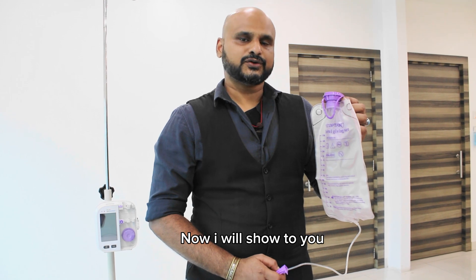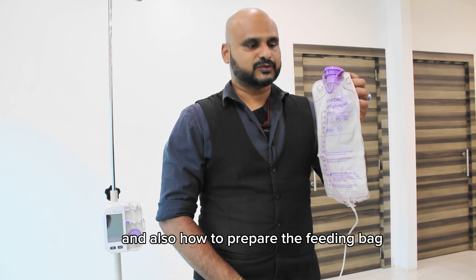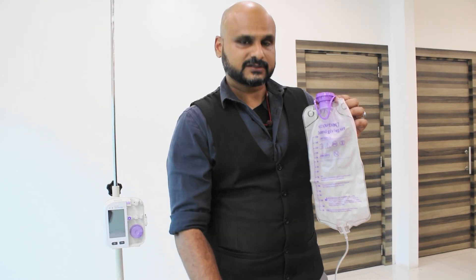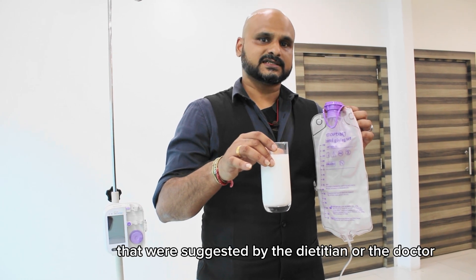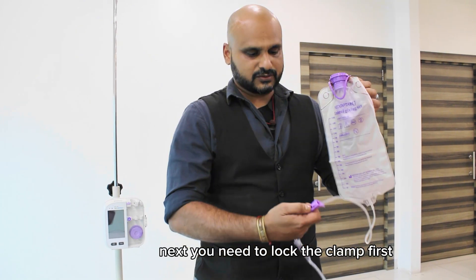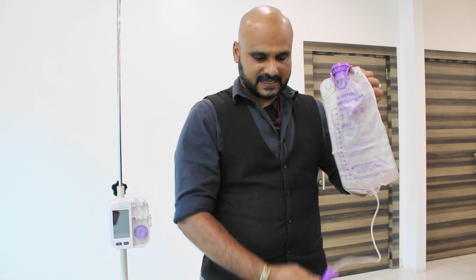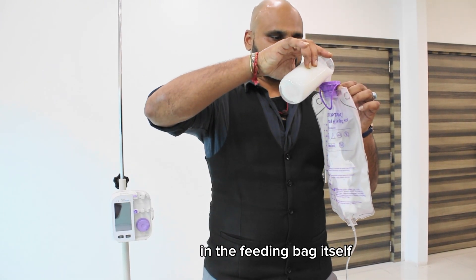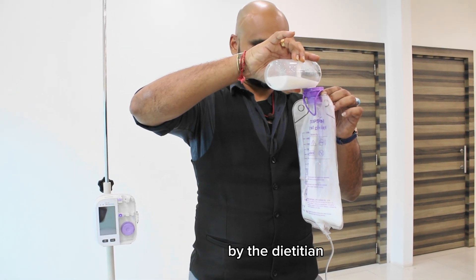I will now show you how to prepare the formula and the feeding bag. First, prepare the formula as suggested by the dietician or doctor. Next, lock the clamp first, then insert the formula into the feeding bag based on the quantity given by the dietician.